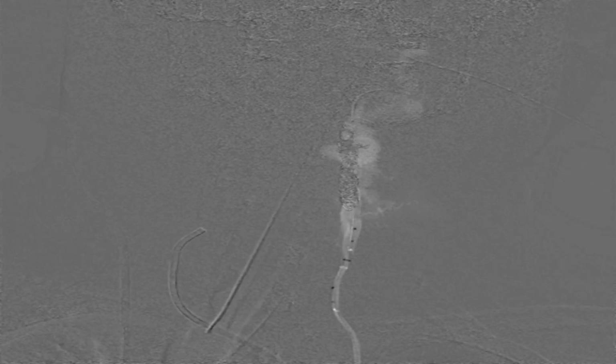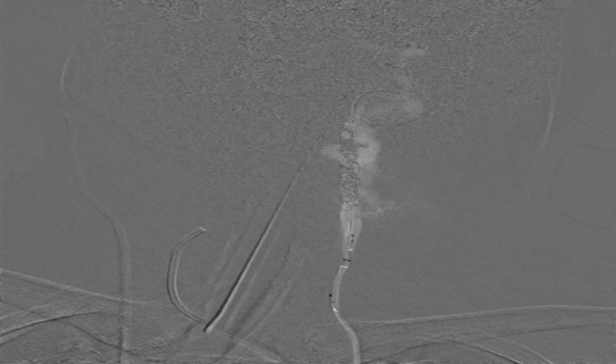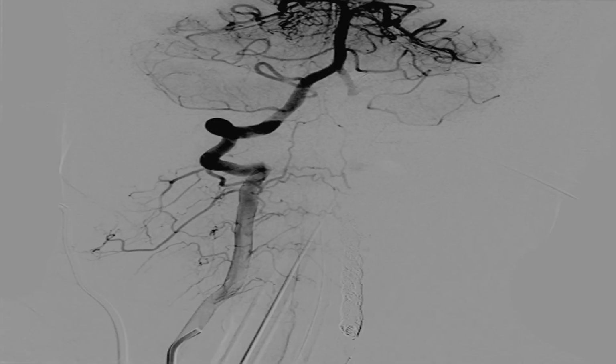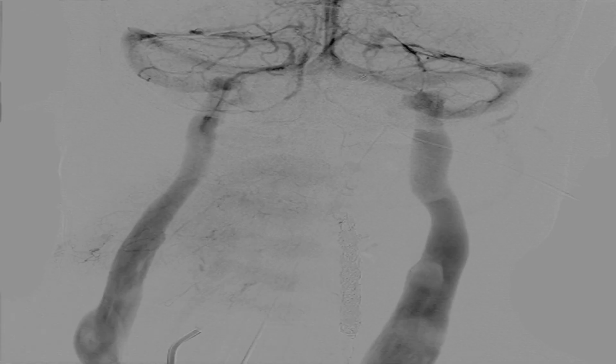Once a sufficient amount of coils are put in to block the artery, the balloon is deflated and gradually withdrawn below the fistula. After putting in more coils, fluoroscopy is again taken from the contralateral side to look for filling of the fistula. This time we can see that no dye is going into the fistula.